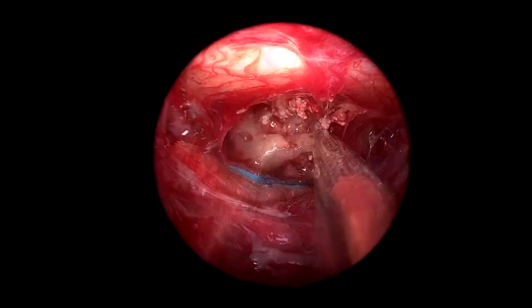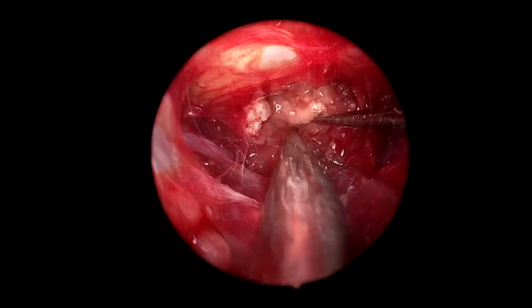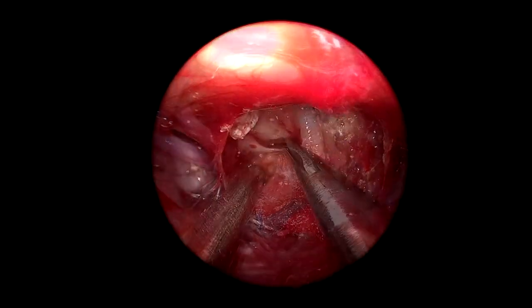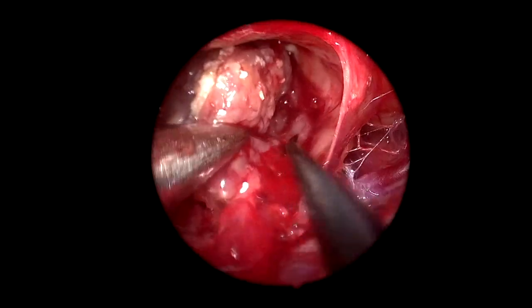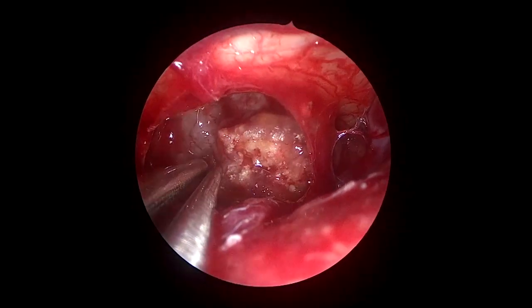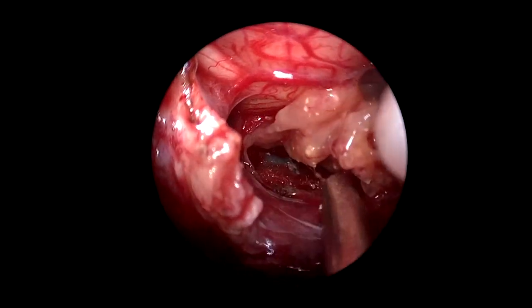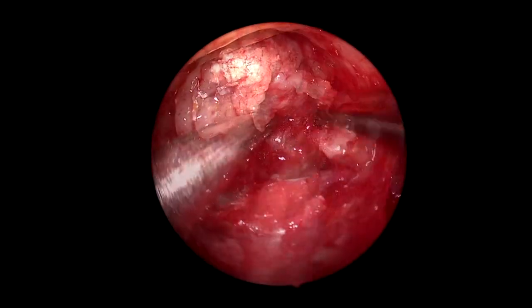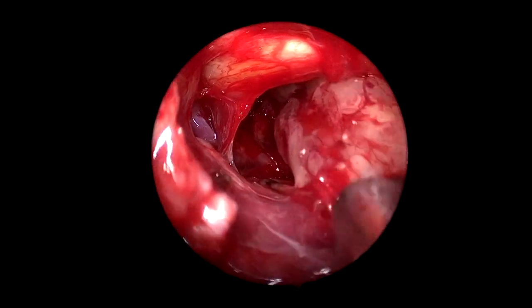We are now exposing the key area at the floor of the third ventricle where the hypothalamic attachment and origin of the tumor is found. We perform very careful, meticulous dissection here to separate obvious tumor from normal hypothalamic tissue. Visualization of this area is outstanding with the endonasal approach. Sharp dissection allows detachment of the tumor, and once detached, the capsule can be pulled off — but not before. The key is to perform sharp dissection from the hypothalamus before any pulling or traction of the tumor is attempted.